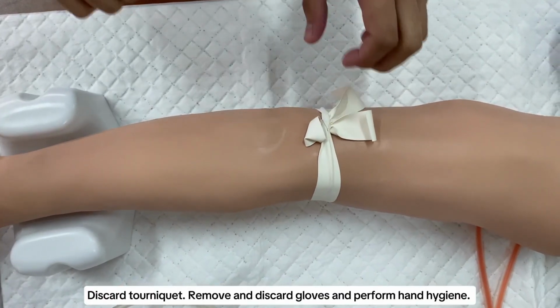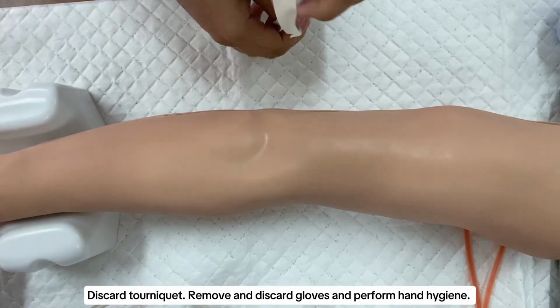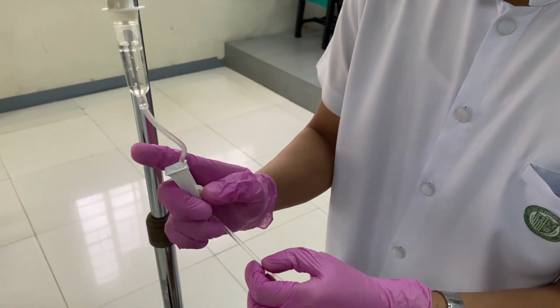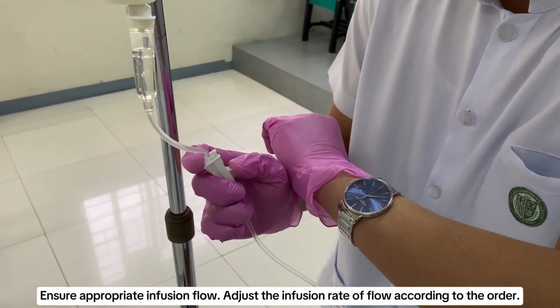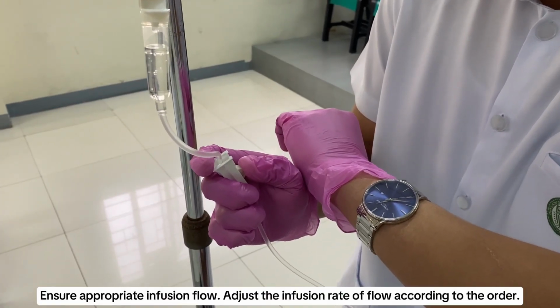Discard tourniquet. Remove and discard gloves and perform hand hygiene. Ensure appropriate infusion flow. Adjust the infusion rate of flow according to the order.